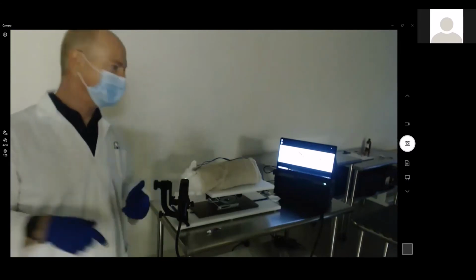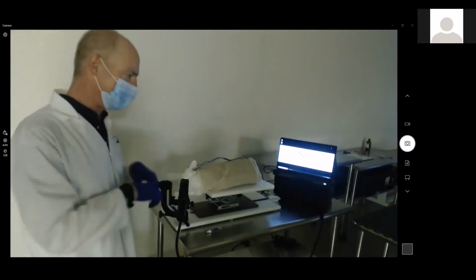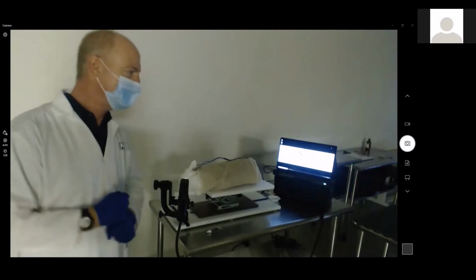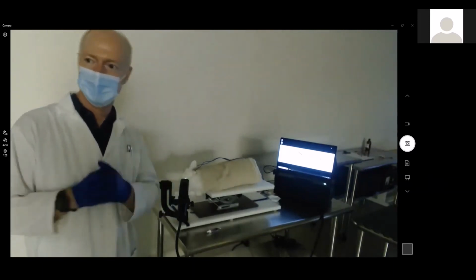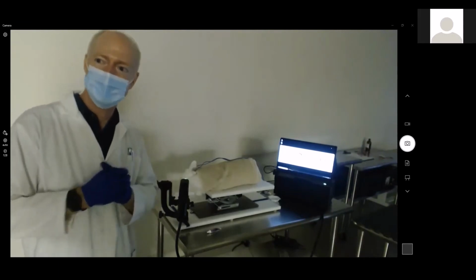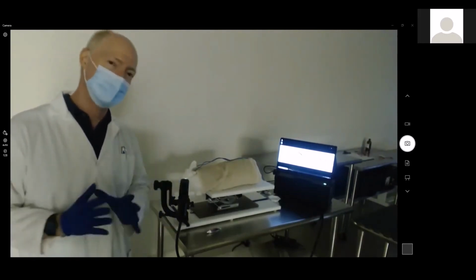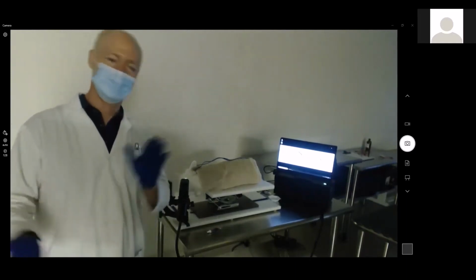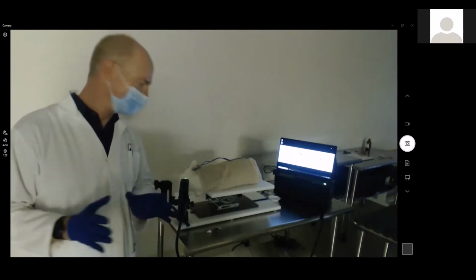So what I'm going to do here is one more exam. We're going to take off this handheld, take it off the scanner, and put it on a handle. Then I'm going to grab my new family member, my new dog Axon, put him on the table, and do a very quick OCT examination. I'm going to attempt to grab his cornea, and I'm going to try to grab his retina, and we'll see how that goes.